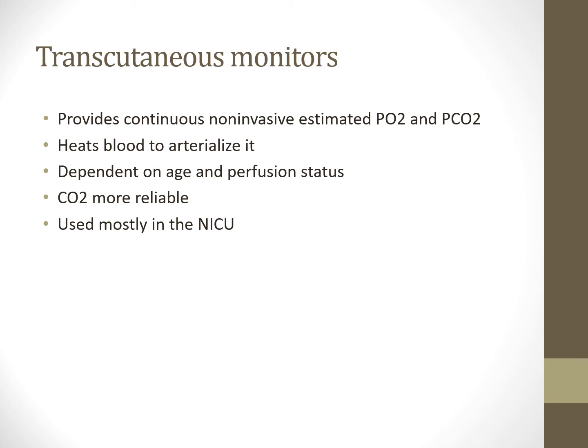Transcutaneous monitors are way more common in neonatal and pediatric patients than adults. There was a study by Respiratory Care Journal, of course, the same journal article that I talked about earlier, where it looked at transcutaneous monitors, and if someone has poor hemodynamics or low blood pressure, then it's not going to be nearly as accurate as if someone had a normal blood pressure. Well, the patient population where you'd want to do continuous oxygen monitoring and continuous CO2 monitoring would be one that's hypovolemic, one that needs it the most. And so it's not going to be near as accurate as a blood gas.